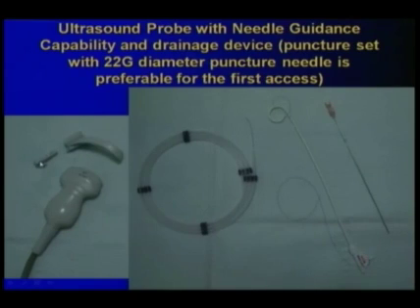different diameter puncture needles, and this is the set for drainage. This is the guide wire drainage set. You see here the puncture needle, which accepts this guide wire, along which we insert the drainage catheter into the target. More and more we use now special sets, which contain a 22 gauge Chiba needle for safe access.